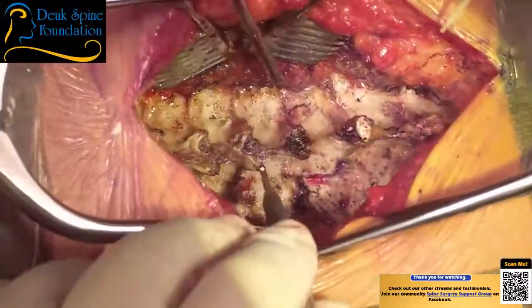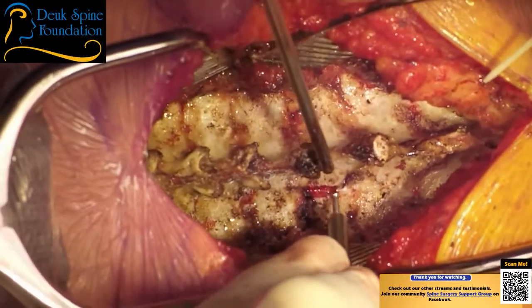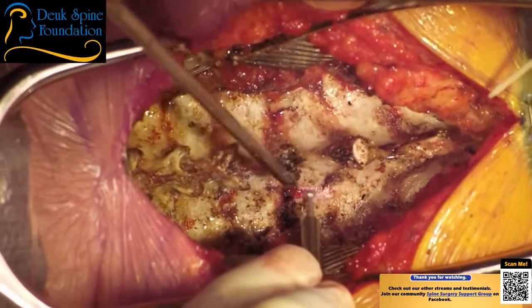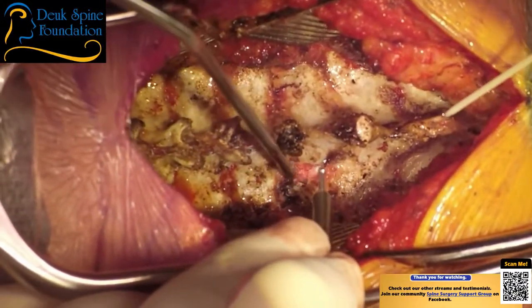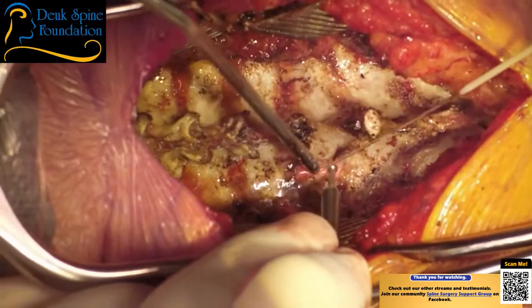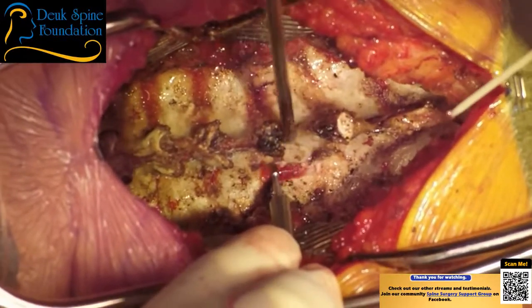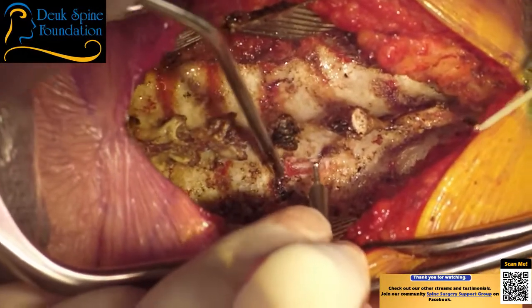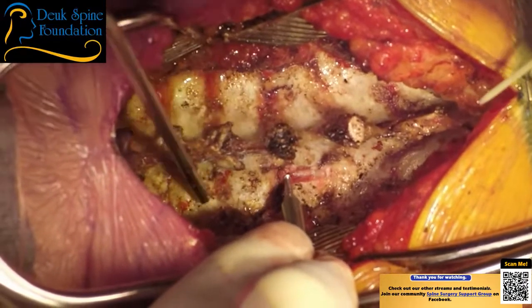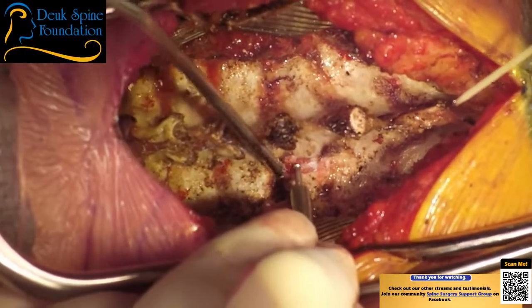Here, I don't need this right now. So I'm using a special drill. It's a spine drill, orthopedic drill, and it has a little bit called a neuro bit. It's a 3-millimeter neuro bit. It's the only drill bit I really use, except when I'm taking hardware out that I can't get out. I use another bit to cut through the metal. Notice how I'm drilling a little bit, and then I'm palpating with the tip of the drill. So a surgeon that knows how to use these drills, we always feel with the tip.